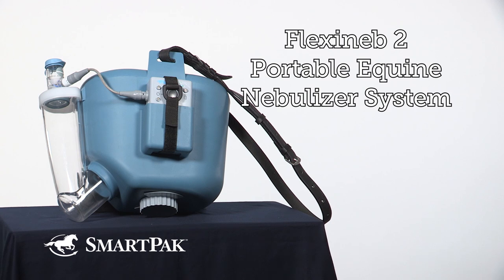I'm Vivian, and the Flexinib II Portable Equine Nebulizer System is my preferred method to administer my horses' airway medication.